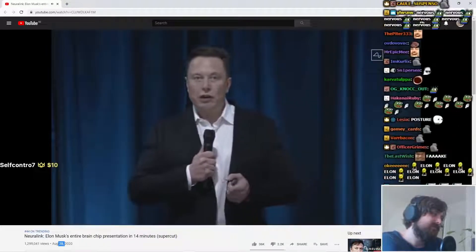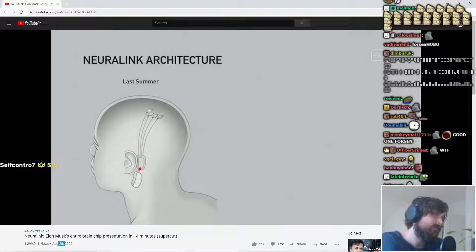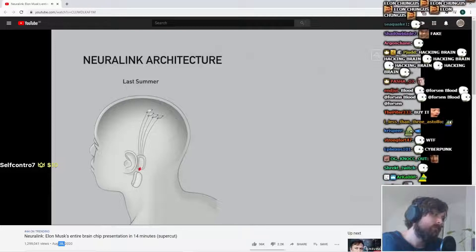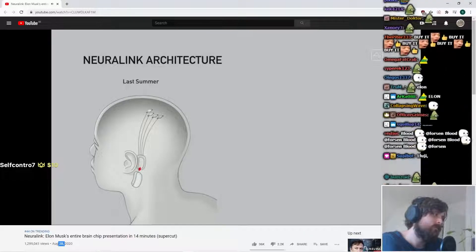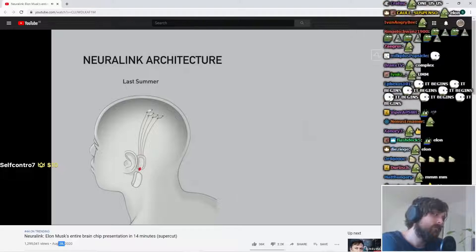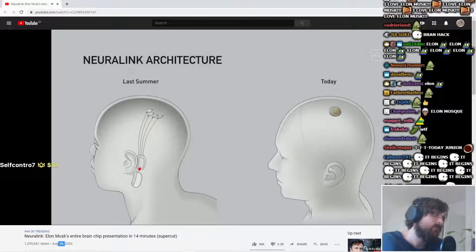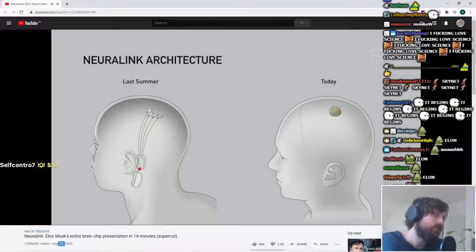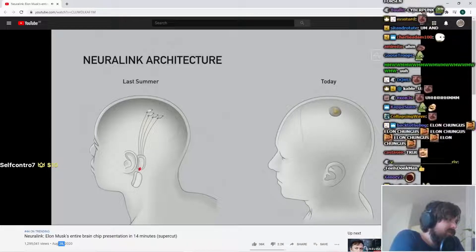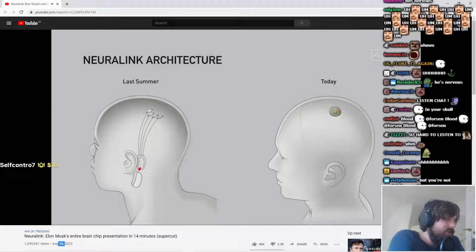Going into the Neuralink architecture, what we've done over the past year is dramatically simplifying the device. About a year ago, we had a device which had multiple parts, including a piece that had to sort of sit behind your ear — and it was complex. You wouldn't still look totally normal; you'd have a thing behind your ear. So we've simplified this to something that goes in your skull, replaces a piece of skull, and the wires connect within a few centimeters or about an inch away from the device.